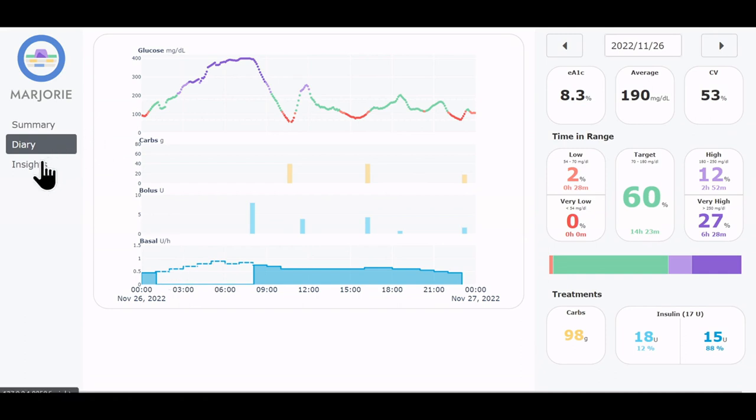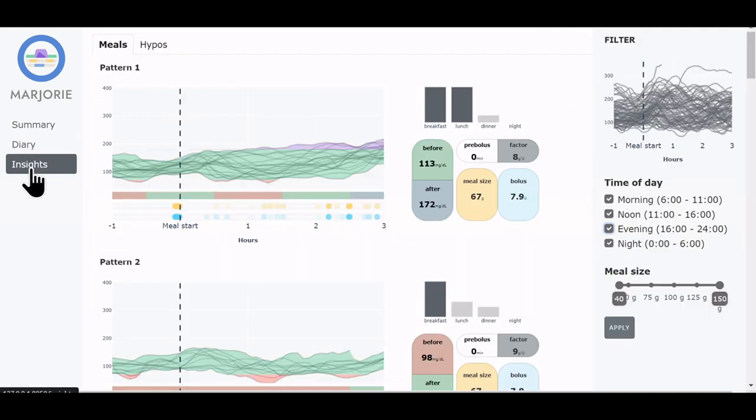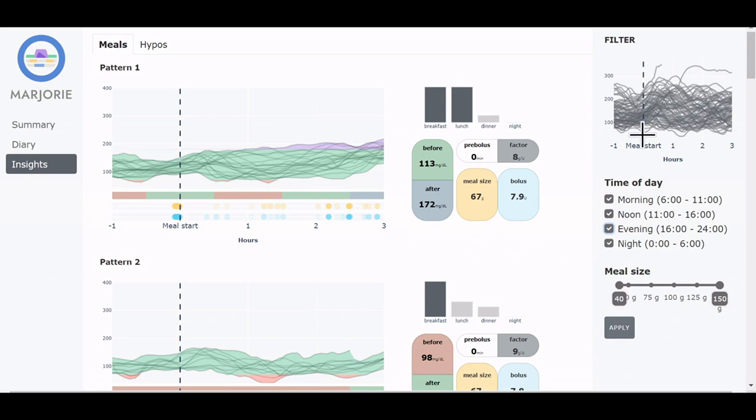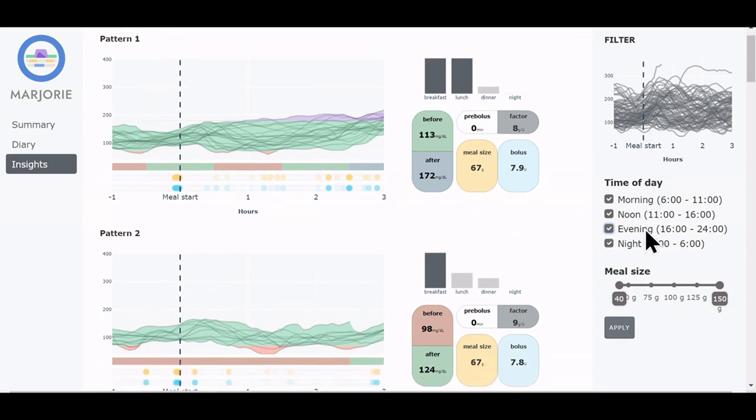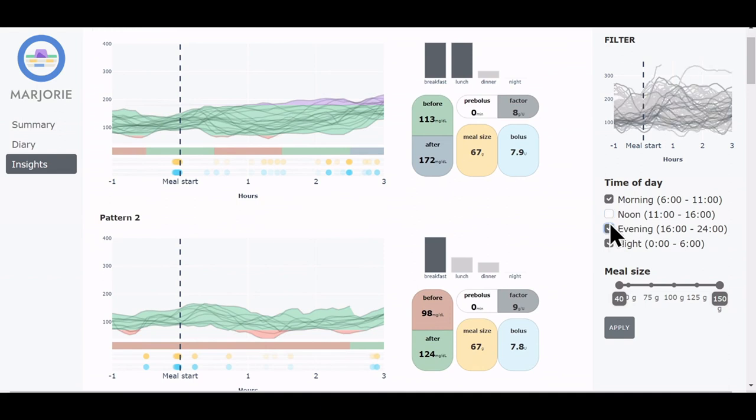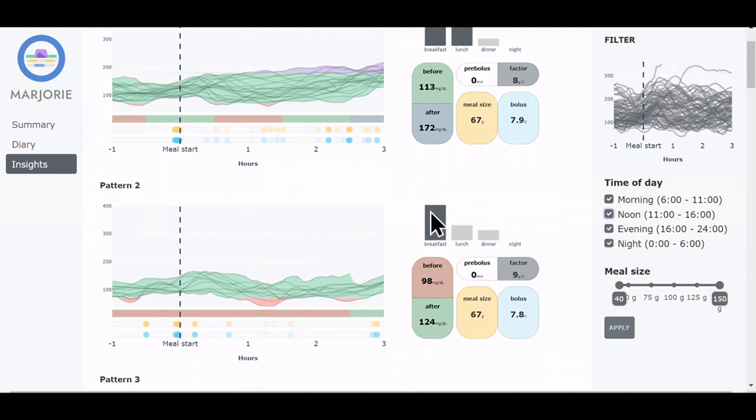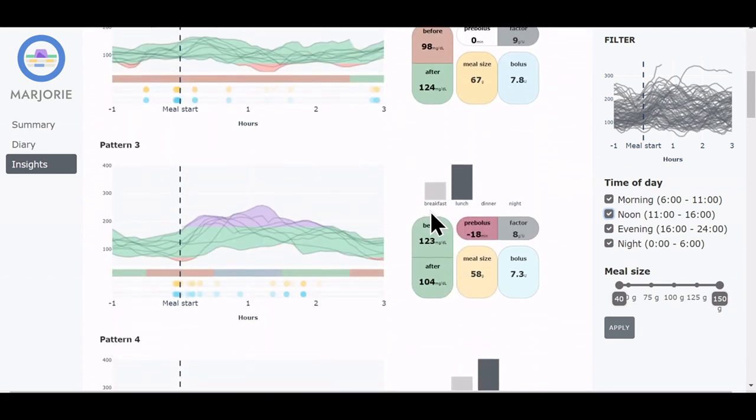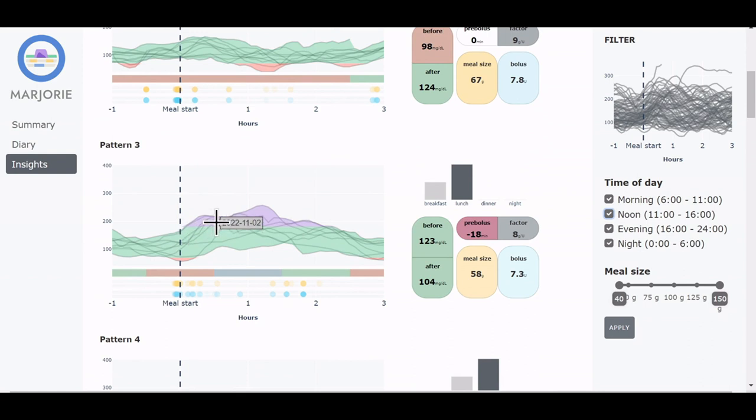Next, we navigate to the insights view. Here, 4-hour windows that contain meals are extracted from the data set and clustered by glucose similarity. This results in a collection of typically occurring glucose patterns during a meal. On the right, there's a filter sidebar that shows an overview of all the extracted data. And users can select a preferred time of day or a preferred meal size they want to filter for. And we can see, for example, pattern 3 shows a summary of situations where the glucose increased after the meal but eventually return to the initial value.